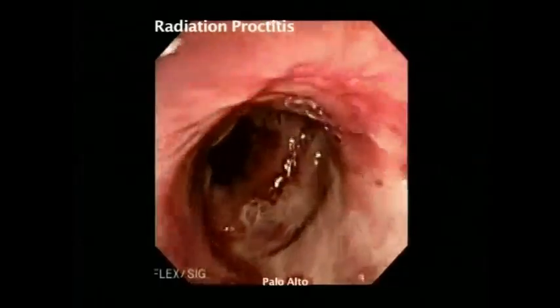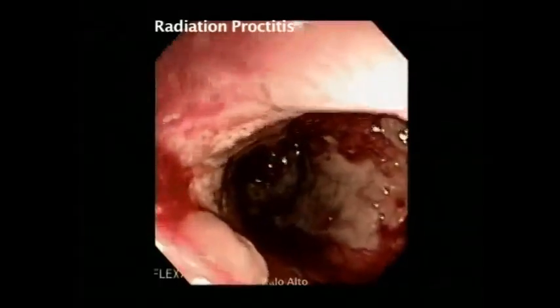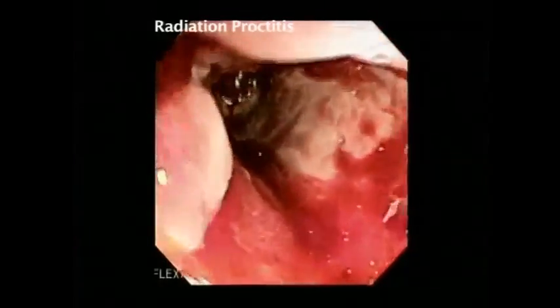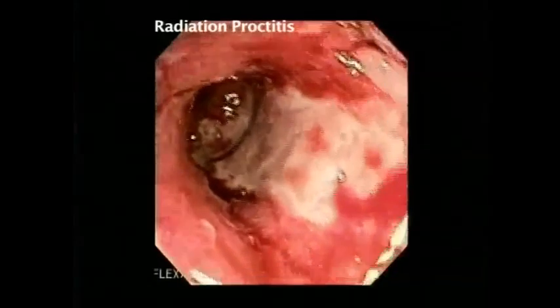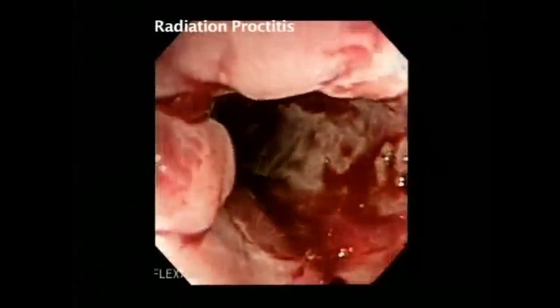Ulceration, friability, and telangiectasias are endoscopically apparent in this patient with a history of radiation exposure for prostate cancer.